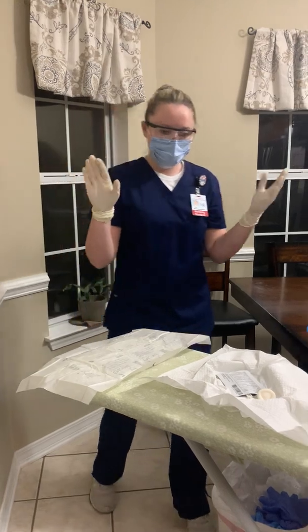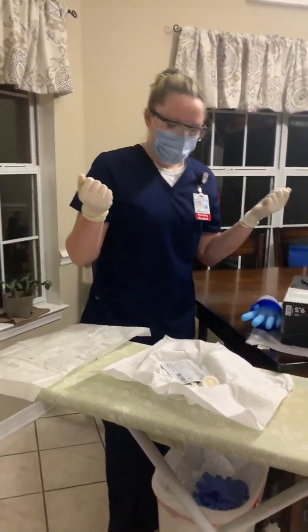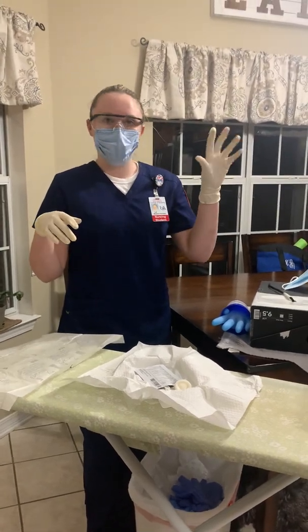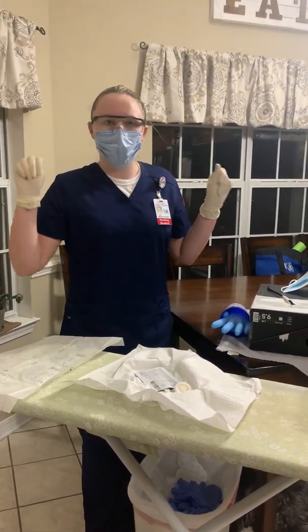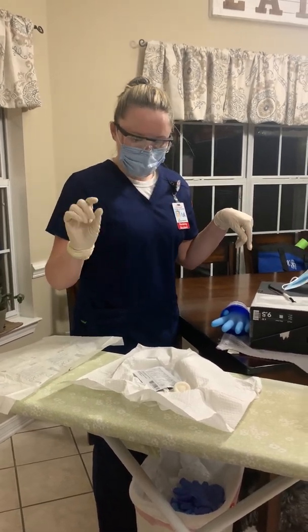Okay, and now I'm not going to touch my wrist because I'm sterile now. During the procedure, this hand will become unsterile and this hand will be sterile, and I'm going to make sure I'm not touching the two. Okay, so now I can move on to cleansing.